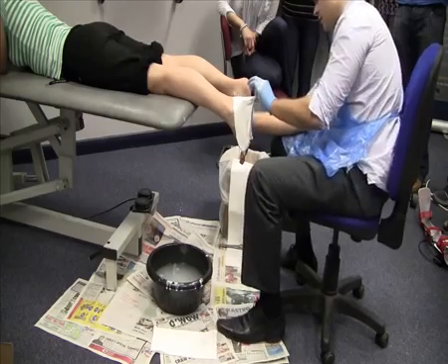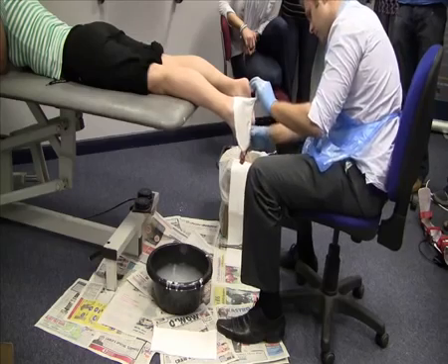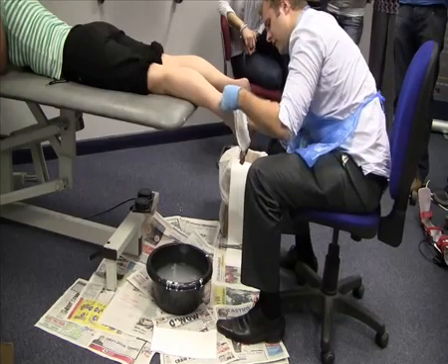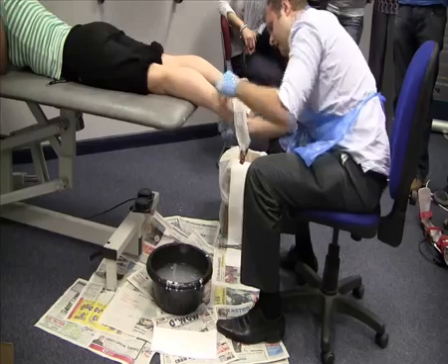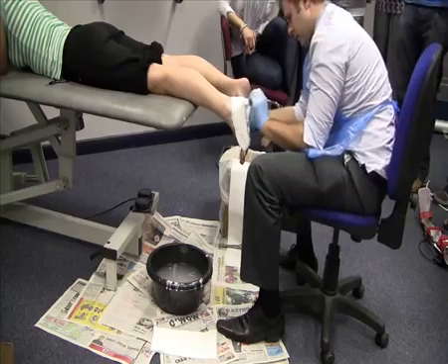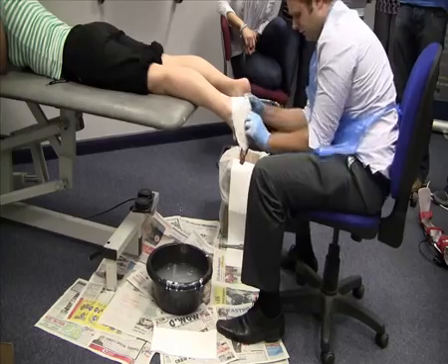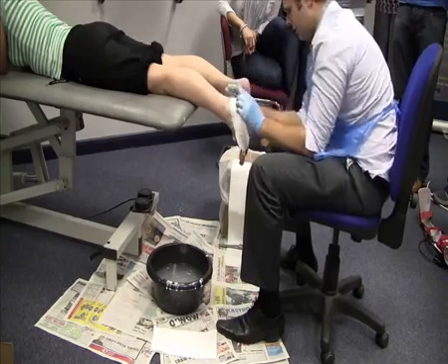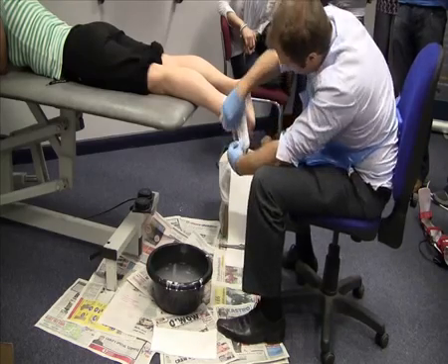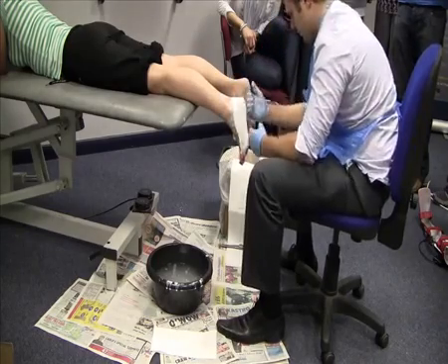This enables you to smooth down the medial side first, making sure that you get rid of all lumps and bumps. Smooth down the medial side. If you need to, you might want to shift it up slightly if you're trying to capture the base of the malleolus. Fold. Try and move that lump away to the side and then smooth down the lateral side, making sure you keep those double edges for easy removal.